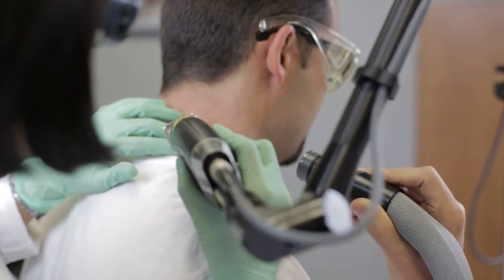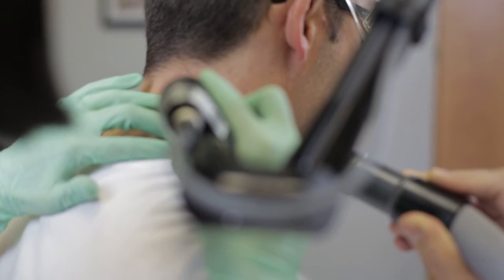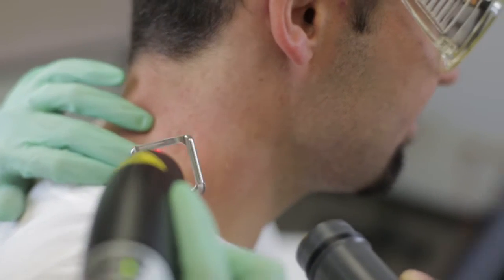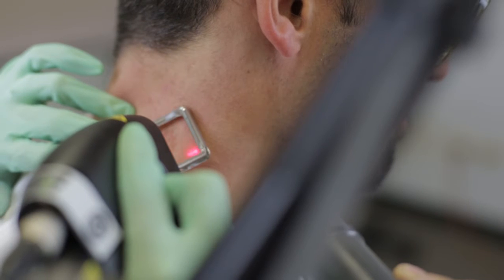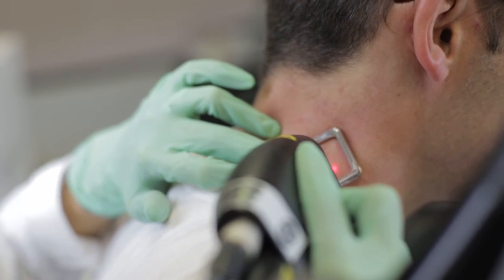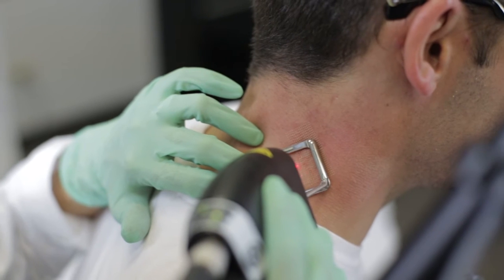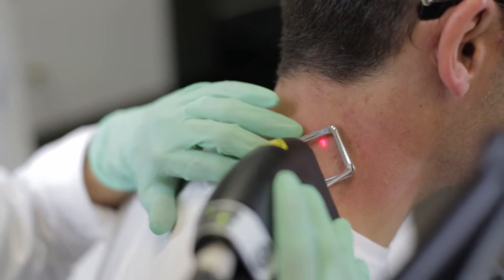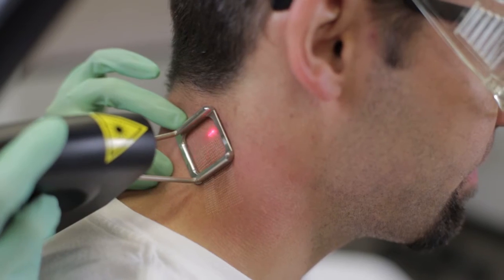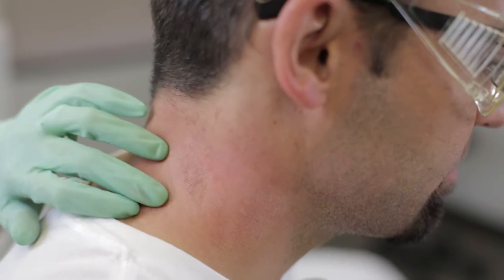We're going to do the first pulse here. It's going to sound like little rubber band snaps. You ready? Here we go. [treatment pulses administered] How are you feeling? Fine. Perfect.